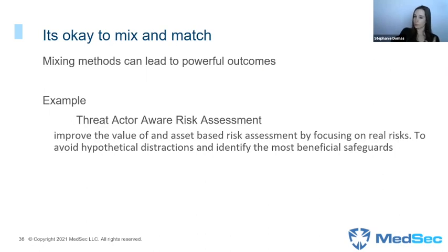If you download that Intel document, what you'll find is they talk about something called a threat actor aware risk assessment, where you can use things like this threat actor library to help with other types of threat modeling. So if you're not completely on board with threat actor modeling in and of itself, and you want to maybe augment your STRIDE, you can totally do that. You will find so much value from mixing and matching the methodologies. Understand it doesn't have to be black and white. You don't have to do only STRIDE or only attack trees or only threat actor. You can get a lot of great value from mixing them.